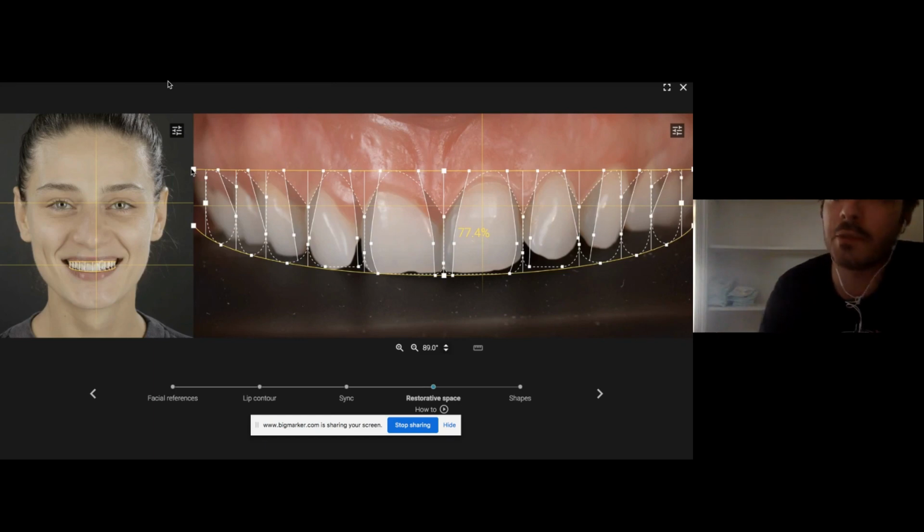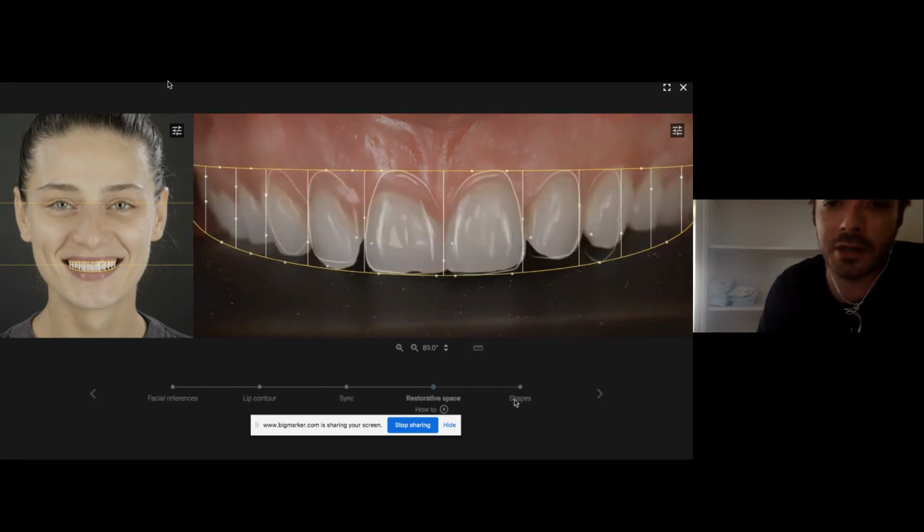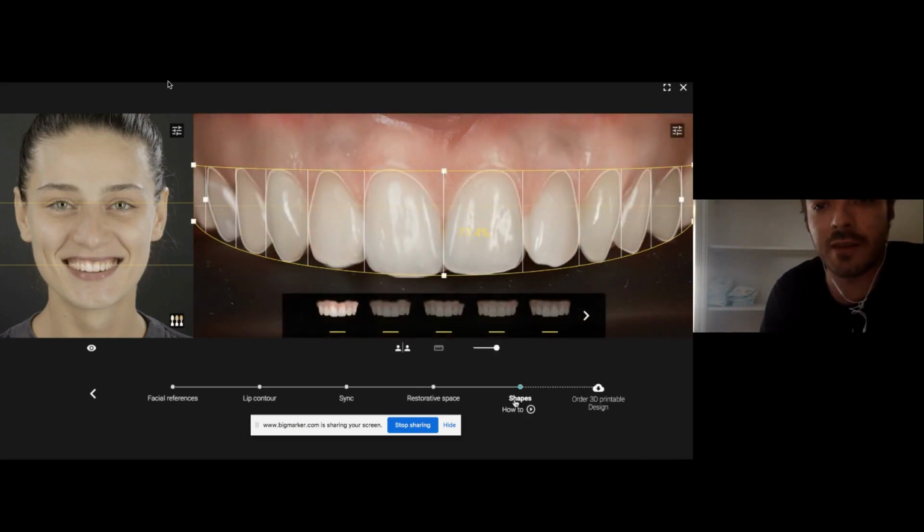In the first step you need to, just like an architect, make a project and be able to render it, to visualize it to the patient. And what we do here is, again, we use a face and an intraoral photo that we synchronize in the software, and then we're going to establish some key parameters, such as curve, or you can see here papilla points, line angles, things which are relevant for the project, which is quite a broad topic in itself, but nothing very fancy or complicated.